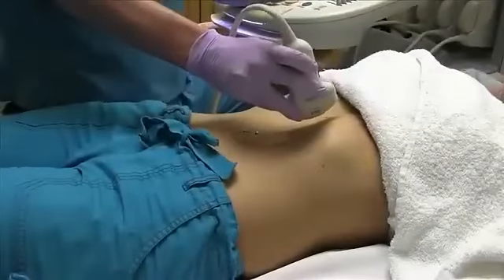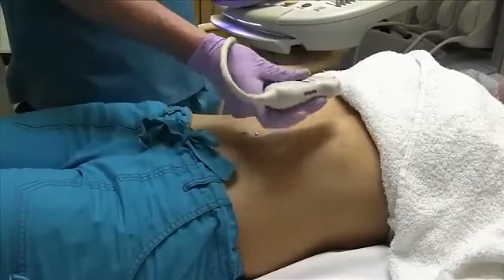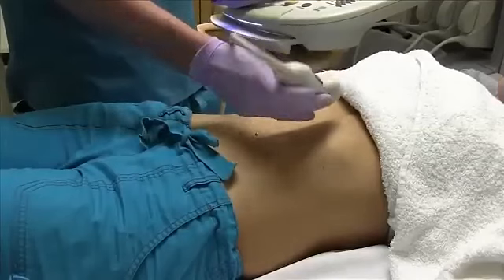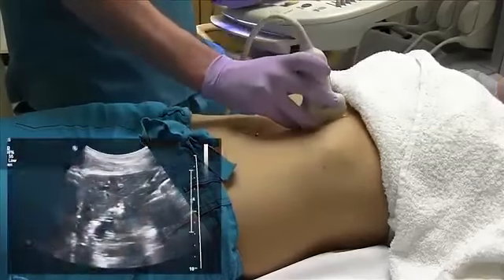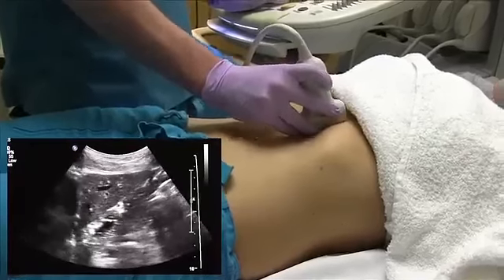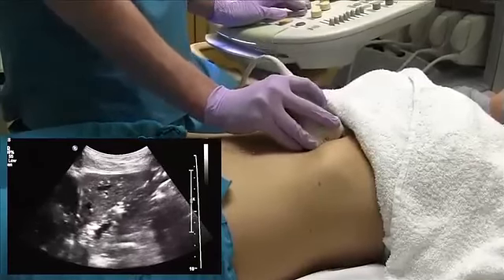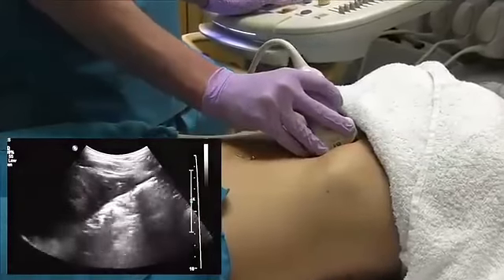So we're going to go over the basic ultrasound scanning technique and scan windows for an abdominal ultrasound today. First, we're going to start with the left lobe of the liver, and to do that we're going subxiphoid, and we're going to first sweep all the way out through the left lobe, start to come back.